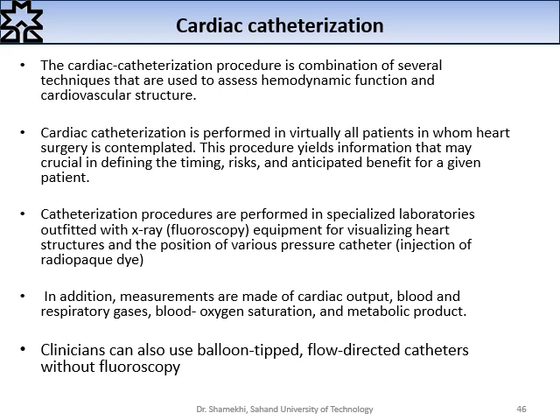Cardiac catheterization is performed in virtually all patients in whom heart surgery is contemplated. This procedure yields information that may be crucial in defining the timing, risk, and anticipated benefit of surgery for a given patient.